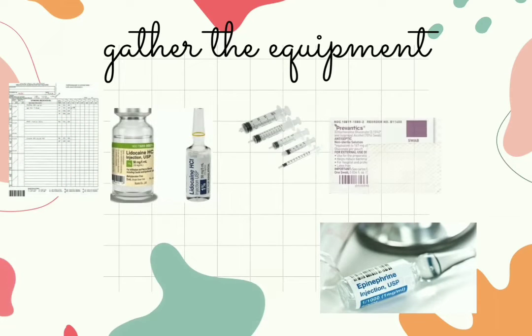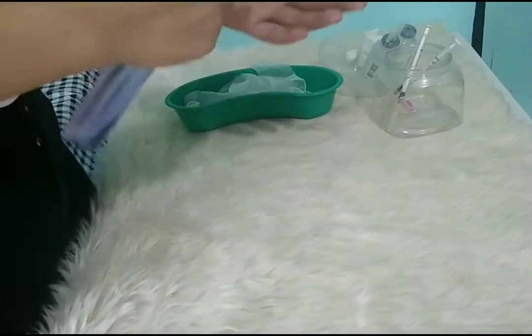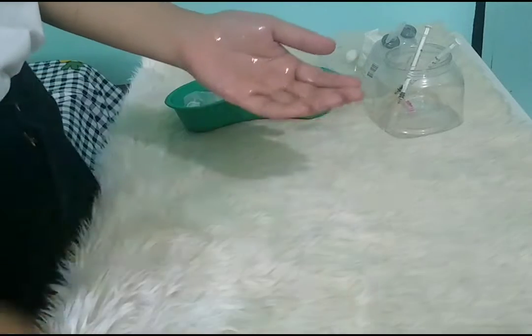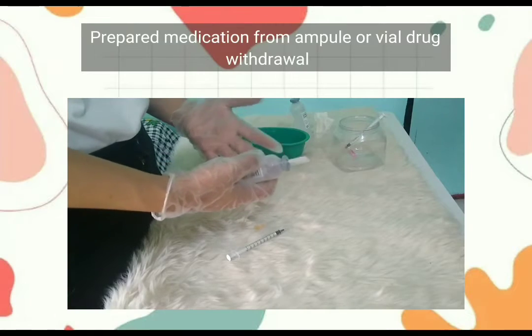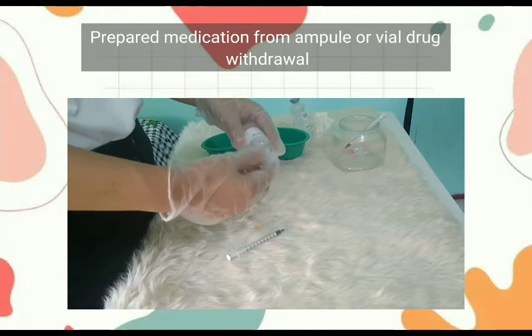Gather the appropriate equipment. First is to perform hand hygiene and observe other appropriate infection prevention control. Now we can prepare the medication from an ampule or vial for drug withdrawal.